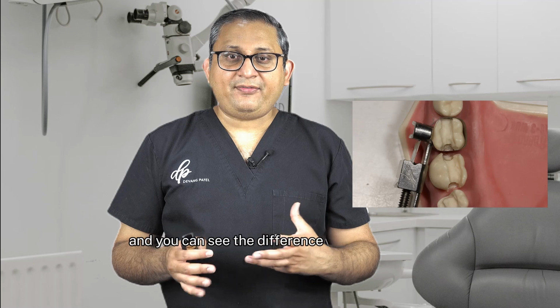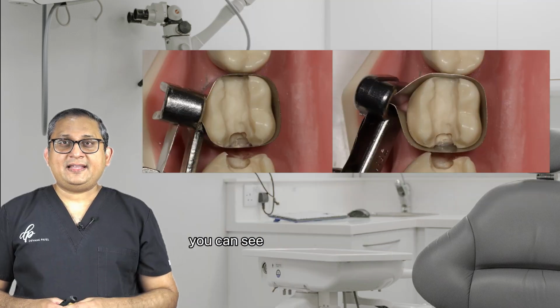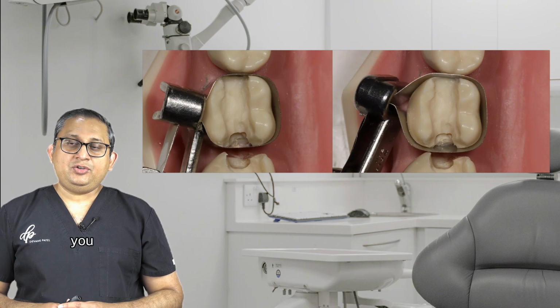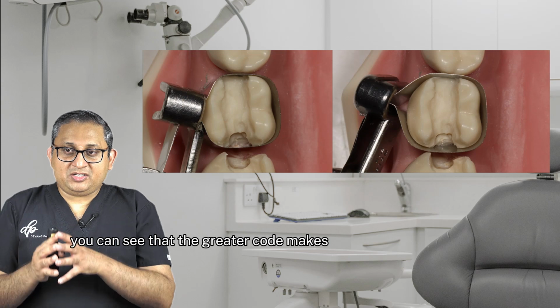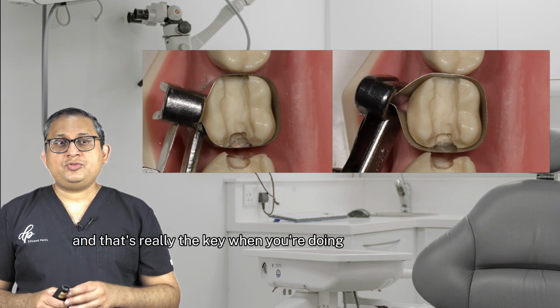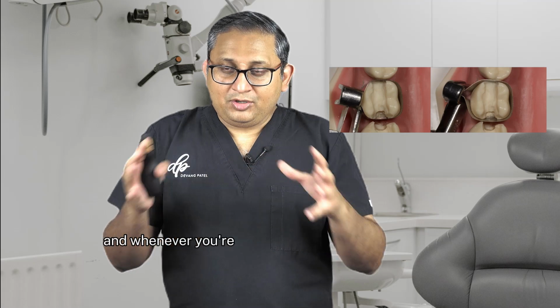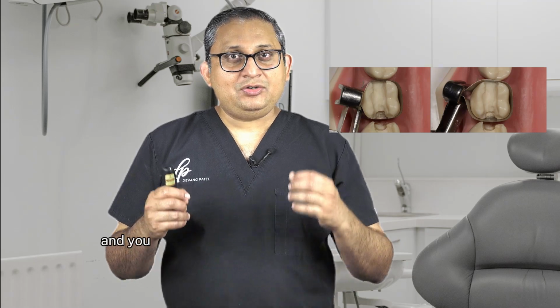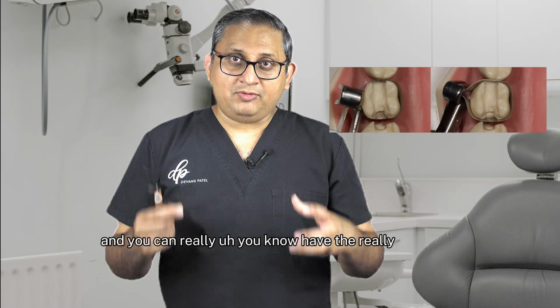And you can see the difference here. On your left, you can see Tofflemire matrix band. You can see that little bit of gap. On the right, you can see that the greater curve matrix band is sealed really, really well. And that's really the key when you're doing deep margin elevation. And whenever you're doing this, you need to really test it. You need to make sure there is no seepage of blood, there is no seepage of saliva, and you have a really good seal.